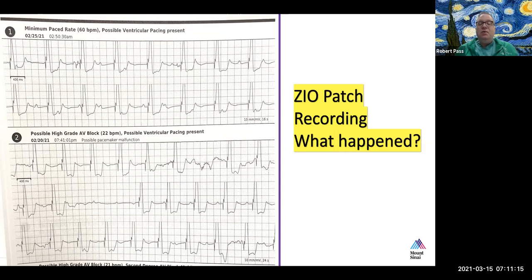But that would potentially invoke the risk that if the patient ever were to have a PVC or spontaneous rhythm at any time, it would be undersensed and it could be dangerous. So we would not generally leave somebody VOO except for a very limited period of time when they were being monitored or observed, such as perhaps during surgery.